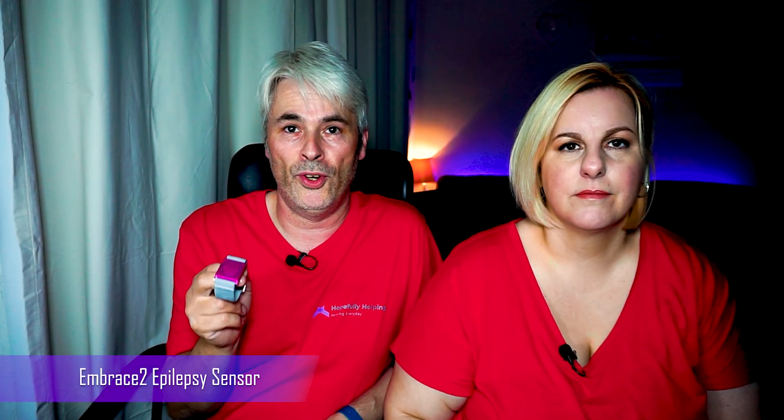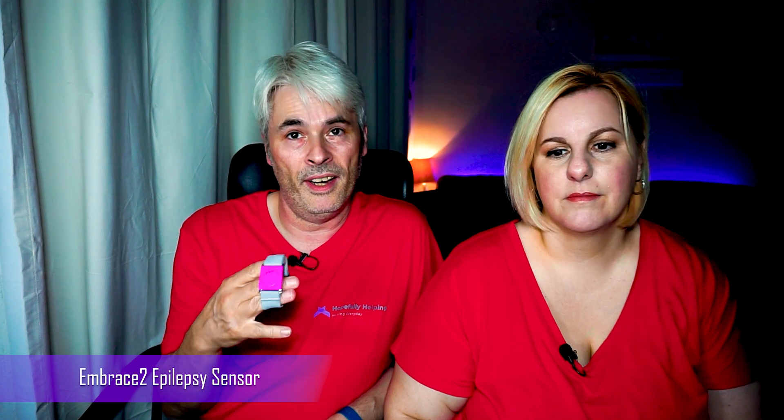Hi and welcome to Hopefully Helping, I'm Gary and I'm Joe. Today we're going to be talking about this — I'll move it out of my face — this is an epilepsy monitoring wristband. My father got it for Hope for medical reasons around our birthday time. It's a little band that sits around the wrist, it's called an Embrace 2 epilepsy sensor and it can connect to a mobile phone by Bluetooth.